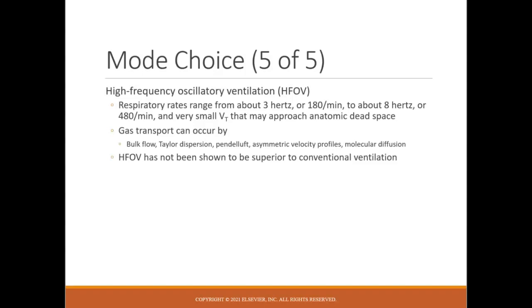The big takeaway with adult use of high frequency ventilation is that it's really not been shown to be superior to conventional ventilation in a lot of scenarios. My theory is that it usually is due to, again, RT comfort. If the only time you ever use a machine is when the walls are crashing down on you and your patient's doing really poorly, that's probably not the time to try to figure out how to best use these machines. You want to have at least a good baseline comfort with them first. So I think that's why it's very difficult to prove that oscillatory ventilation works, just because people aren't as comfortable with it. Clinicians, I mean.